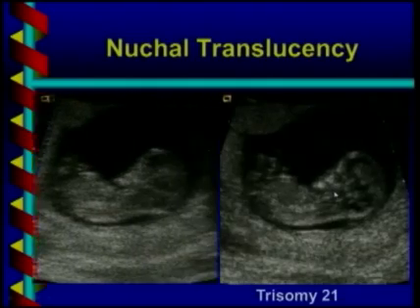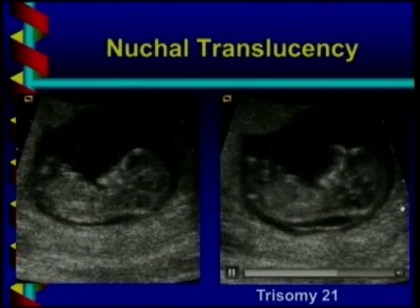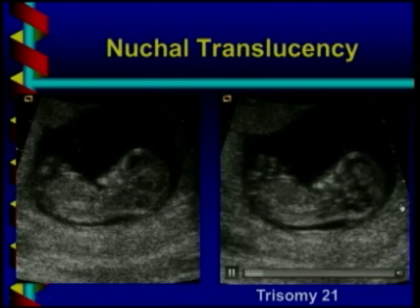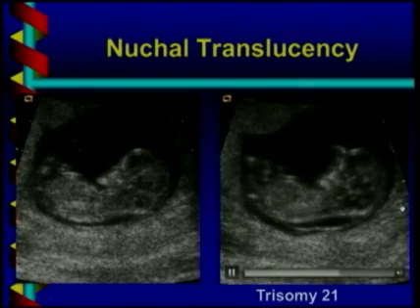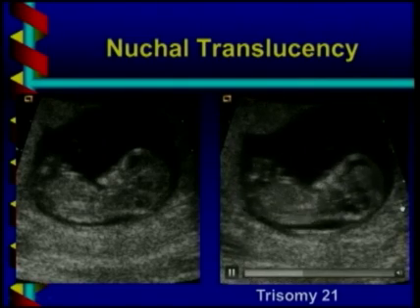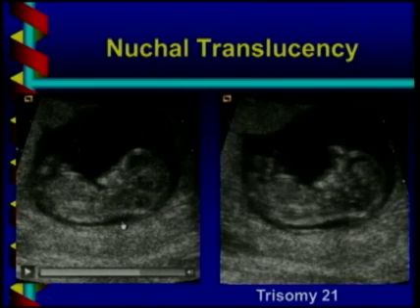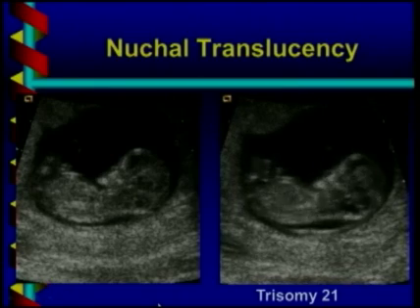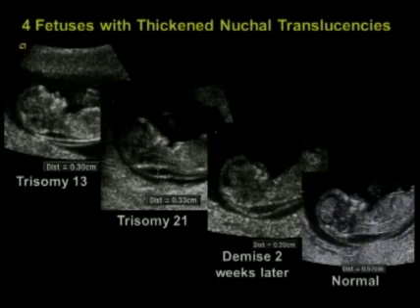making you wonder whether this whole thing is a thick nuchal translucency. And in fact, when the baby jumps up, you can see that she has a thick nuchal translucency. That led to concern that she might have a chromosomal abnormality. And in fact, this fetus turns out to have trisomy 21. So don't ignore looking at the nuchal translucency, looking at the region behind the fetal neck in cases when a woman isn't planning to have a serum screen or if you're not NT certified.